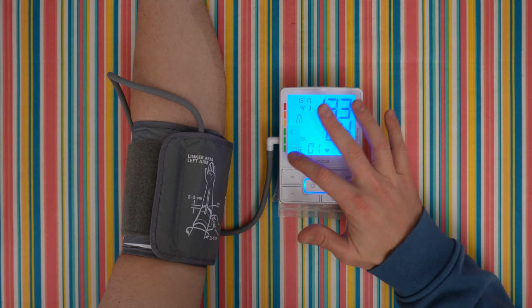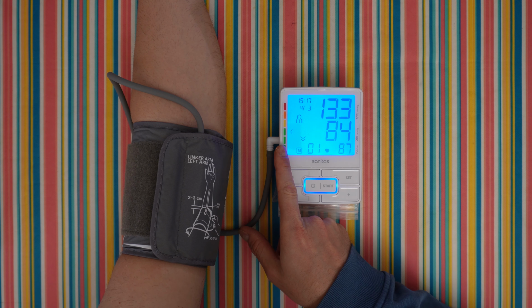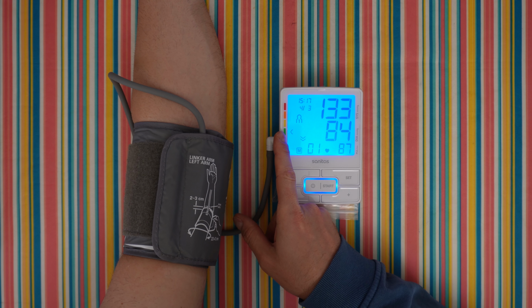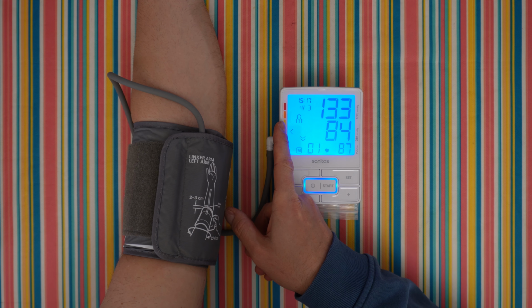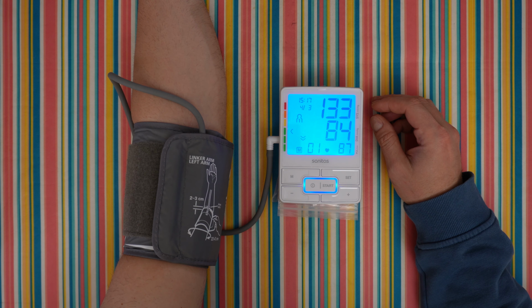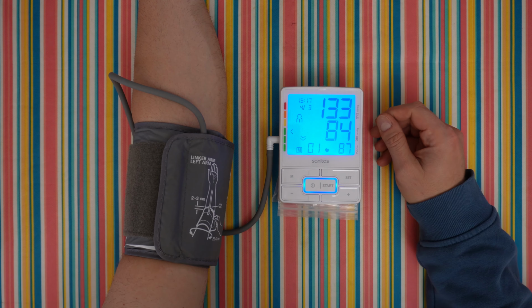Here we can see the risk detector. Three bars: green bar one, it is optimal, green bar two, it is normal, green bar 3, it is high normal, yellow level 1, mild hypertension, orange level 2, moderate hypertension, and red level 3, severe hypertension. And of course we can see the hour, the month and the day.